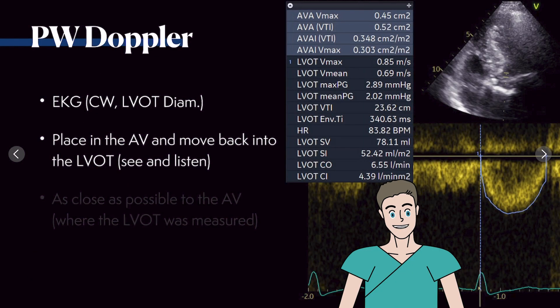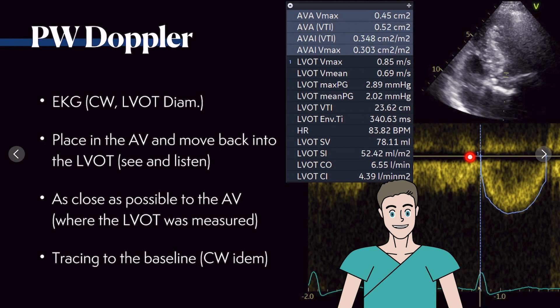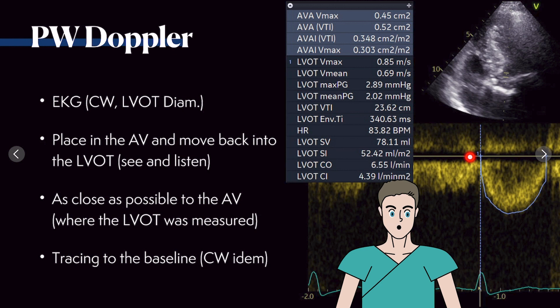Moving on to the pulsed wave Doppler. The pulsed wave Doppler is the second Doppler we need for aortic stenosis. We need it placed directly in the LVOT — optimally where you measured the LVOT diameter, which is very often quite difficult. Keep in mind that there is a certain degree of error in this measurement simply because you are sometimes a little bit off.